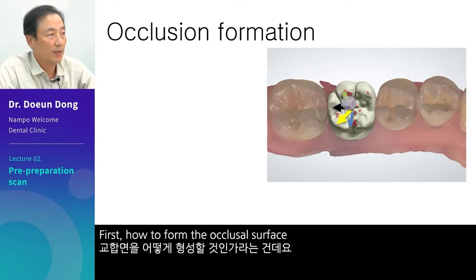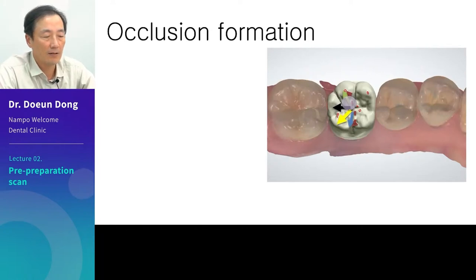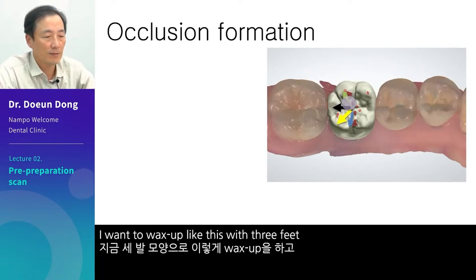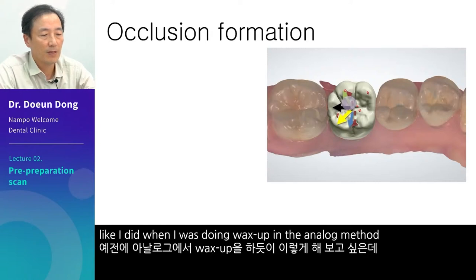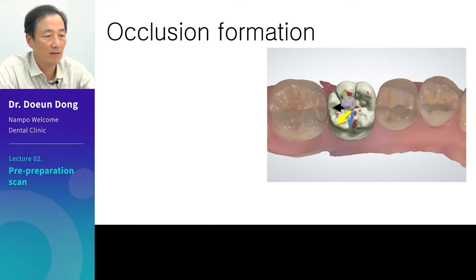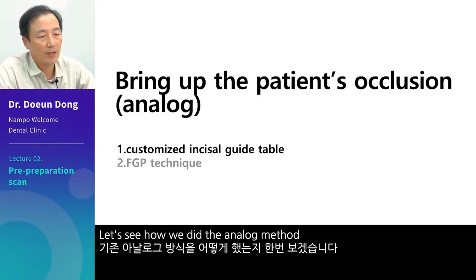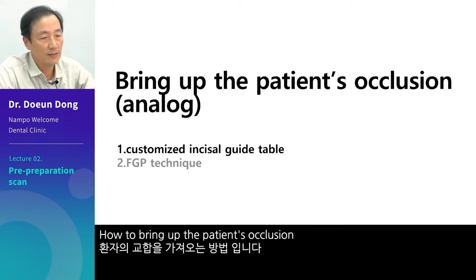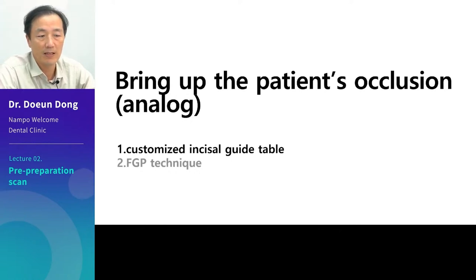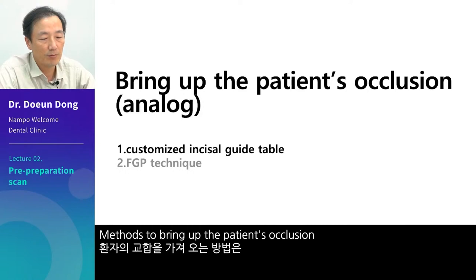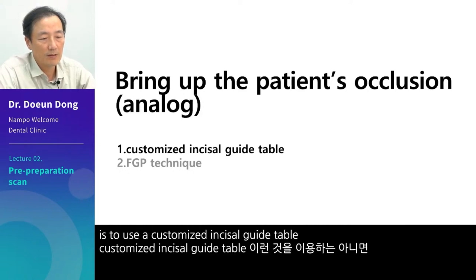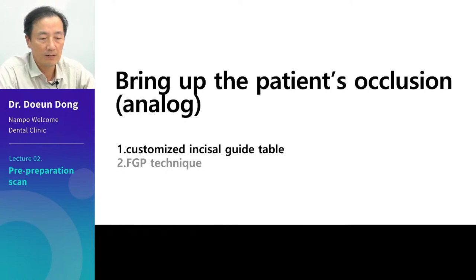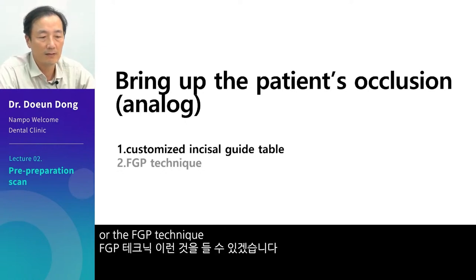First, how to form the occlusal surface. I want to wax up like this with three feet, like I did in the analog method. Let's see how we did the analog method — how to bring up the patient's occlusion. Methods to bring up the patient's occlusion include using a customized incisal guide table or the FGP technique.